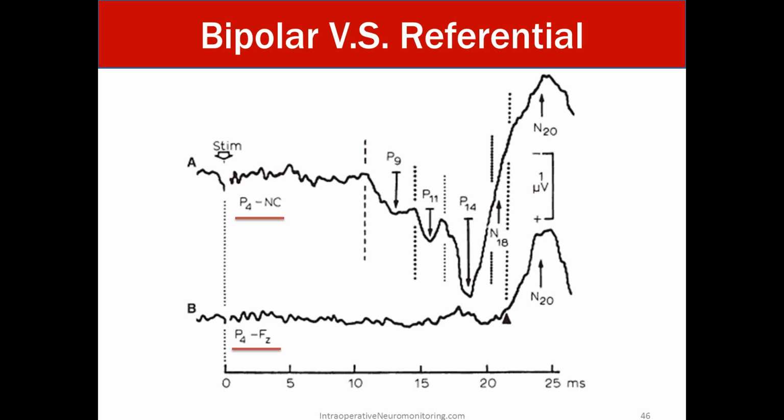If this was the lower extremity, then it would be looking at some kind of spine response, most likely having an electrode over the L4 spinous process and the iliac crest, looking at when the dorsal root entry zone happens with the conus, cauda equina.